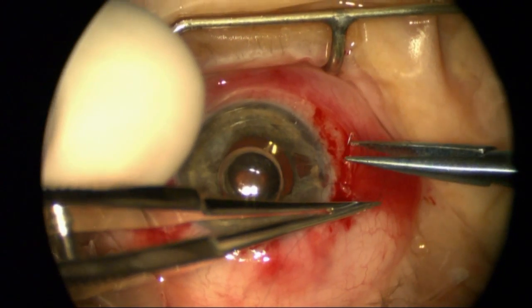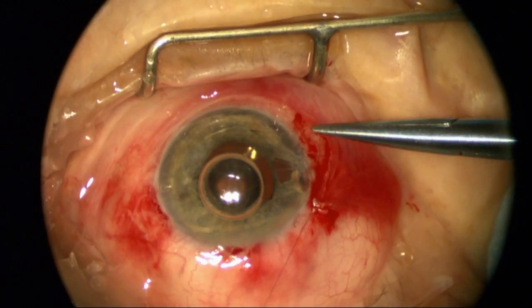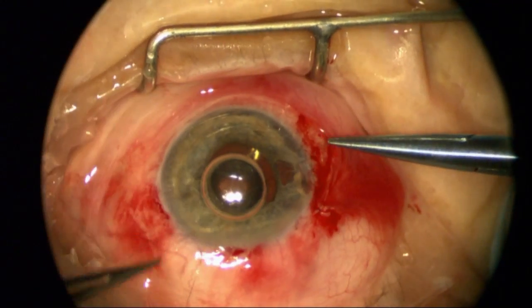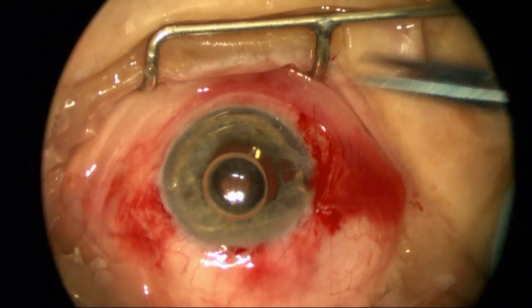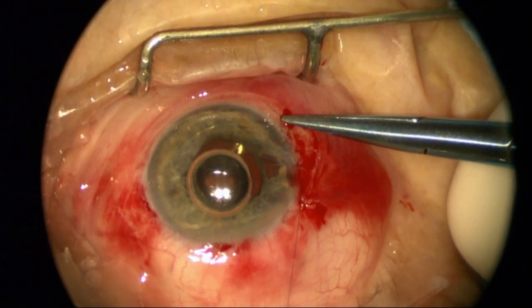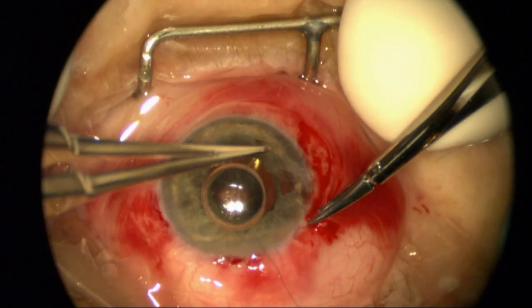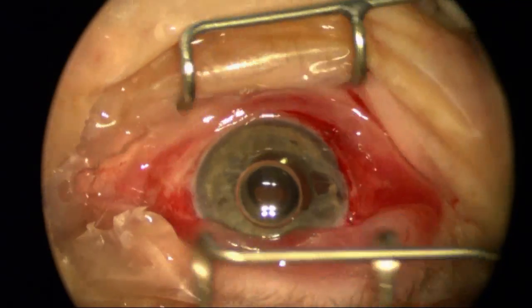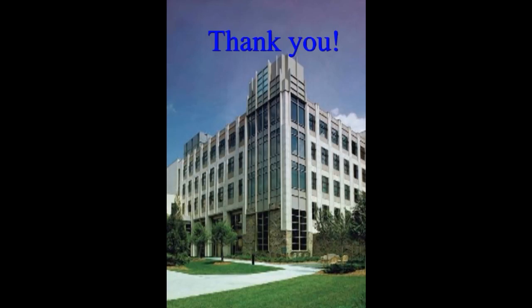I'm going to rotate the knot into the sclera and then close off that area with conjunctiva, with the knot buried underneath. In the end, it was an extremely satisfying result. The patient and family were very, very happy on day one after surgery, and the patient has done extremely well. Thank you.